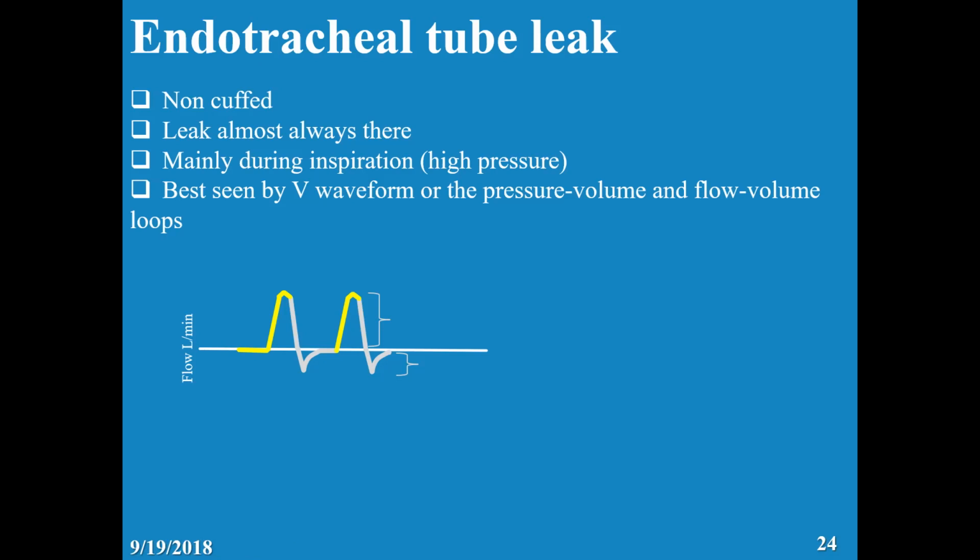If the out is more than the in, from where is this out coming? There should be air trapping. Trapping somewhere. Yeah. Is that clear? Yes, yes, it's clear.